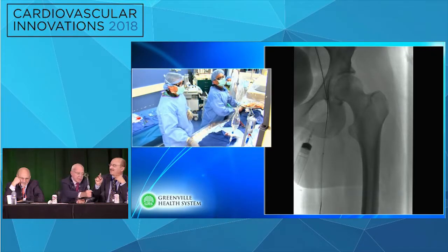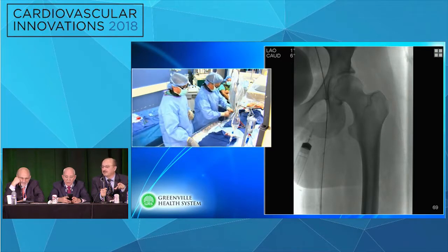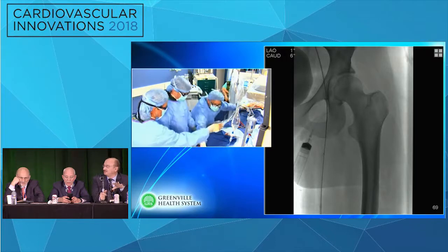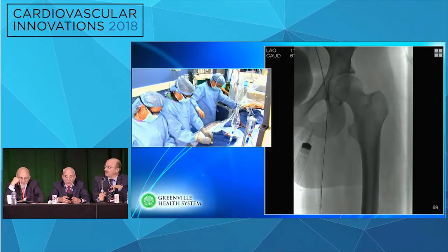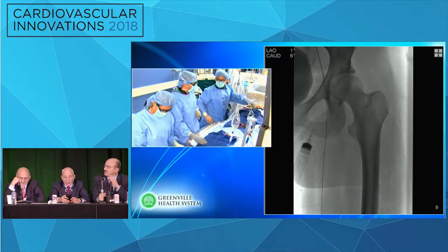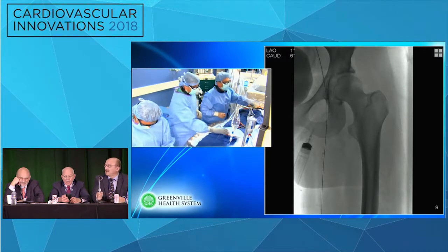Yeah. You know, I know you don't like to hear that. I think this is a really good case, because of her age, for endarterectomy of the common femoral vein and stenting the rest of the vein. Endarterectomy? Yeah, endarterectomy of the common femoral vein, clean everything. To be honest, I won't acknowledge publicly, this is new to me. Oh, no, we do it. Actually, with those cases, clean it. It cleans better than the artery. And then do the stenting after that.